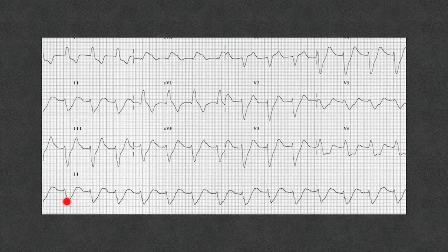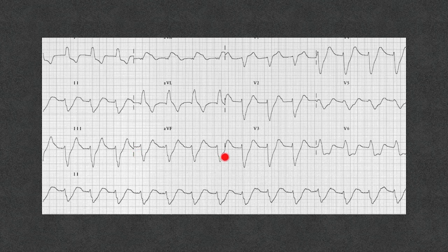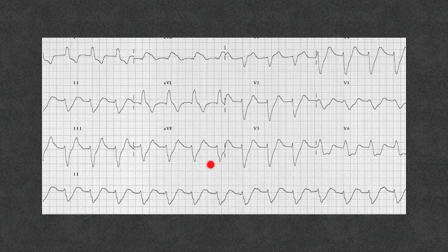Another EKG showing wide complex rhythm with borderline tachycardia — not fast enough to call ventricular tachycardia. There are no recognizable P waves and the morphology meets criteria for left bundle branch block. It looks almost like sine waves — suspect hyperkalemia immediately, especially if these are acute changes. If you have a baseline EKG to compare to, I would start treatment immediately before getting the potassium level.